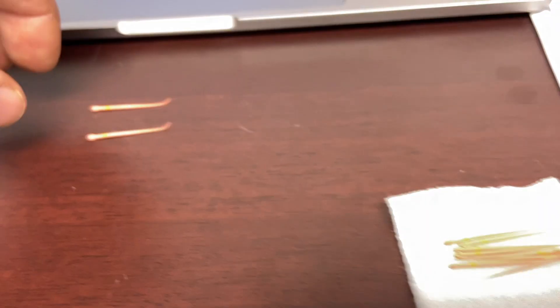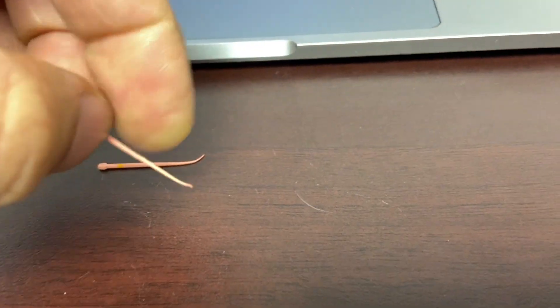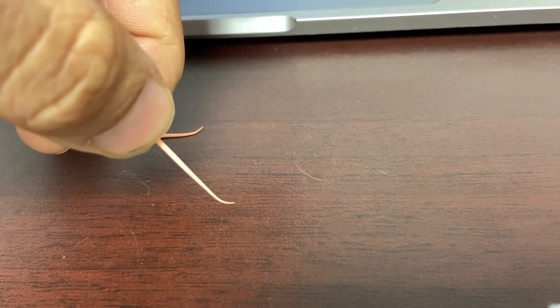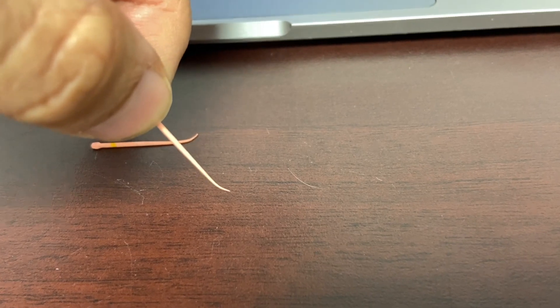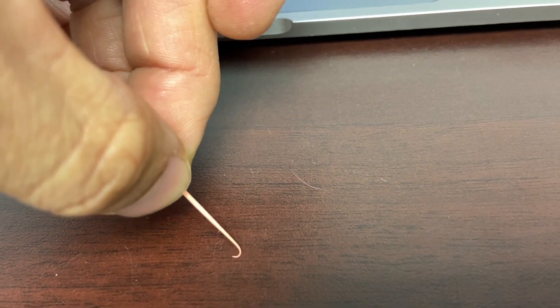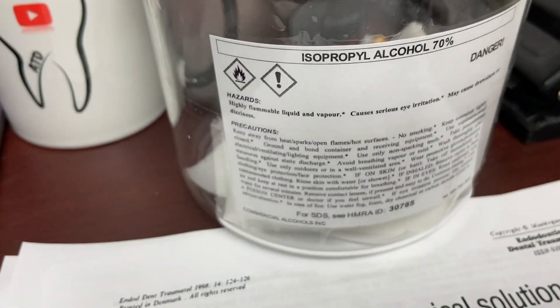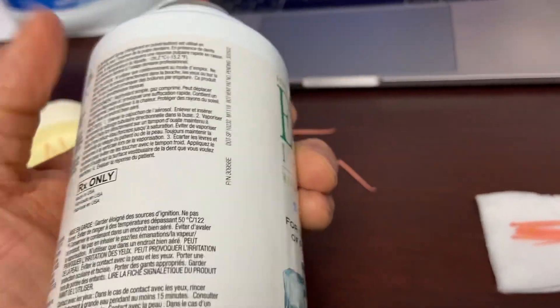The last thing is: if you've got a curved canal and you're trying to get your gutta percha points around it, sometimes what happens is you curve your gutta percha to get it around that curved canal, and the darn thing straightens — it's like a noodle. What you can do — there are lots of ways, you can take alcohol — you can also take your endo ice.